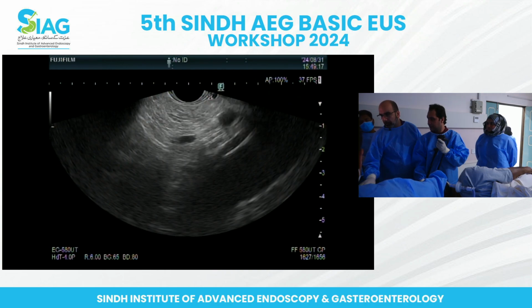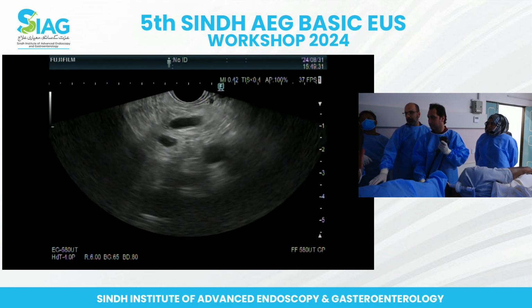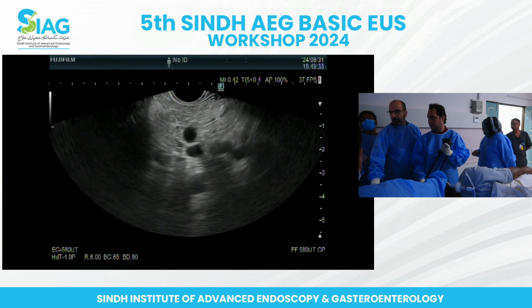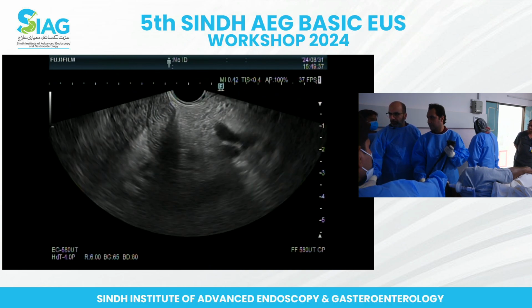Where is it? Is it free? But yeah, there you go. But this is your pancreatic duct. So you're going to follow it to the left there. Okay. So go ahead. Keep going leftwards. Keep going counterclockwise. There you go. Keep going. Keep going. Keep going.